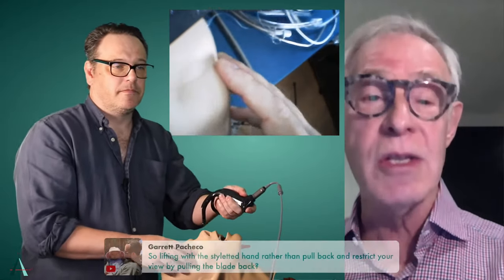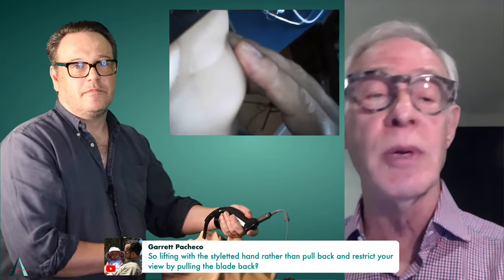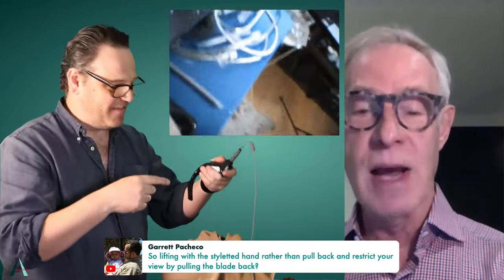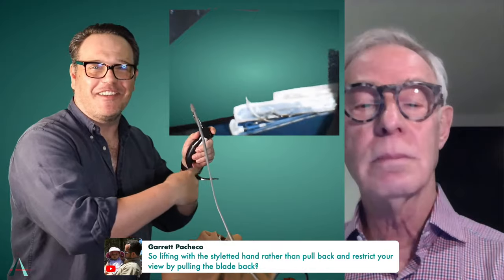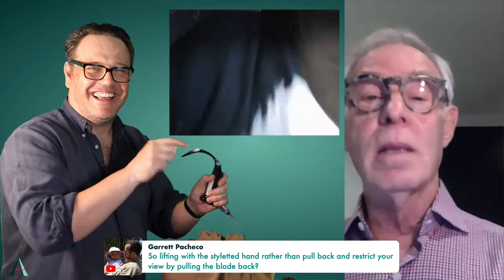The technique, yes. The lubrication, I apply that with any laryngoscope, hyperangulated, Macintosh, direct or indirect. I found that it's particularly useful in the afternoon when they've got a dry mouth. What I've found is that people get very confused about what's the top of a hyperangulated blade. I thought that was obvious, but every time I do it, someone lubricates what I would call the bottom. I think because they hold it like this.